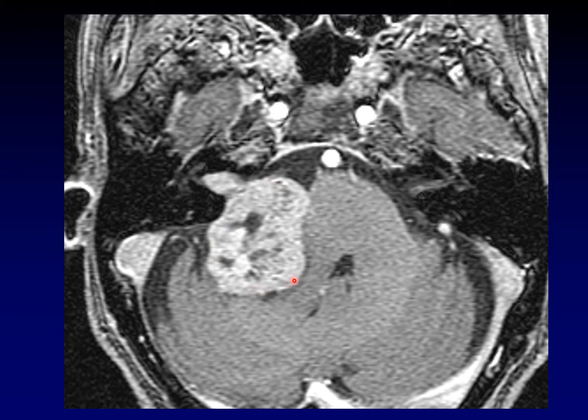Let's look at the heterogeneity of enhancement. Non-enhancing scattered areas throughout the mass, much more consistent with an acoustic neuroma. How about the relationship to the underlying bone? Notice that this mass makes acute angles with the underlying bone. It is not broad-based. The portion of the tumor that attaches to the bone is not the widest part of the tumor. That's what we mean by broad-based. This has an acute angle with the underlying bone. That is, in my opinion, the most important sign that you are dealing with a vestibular schwannoma.